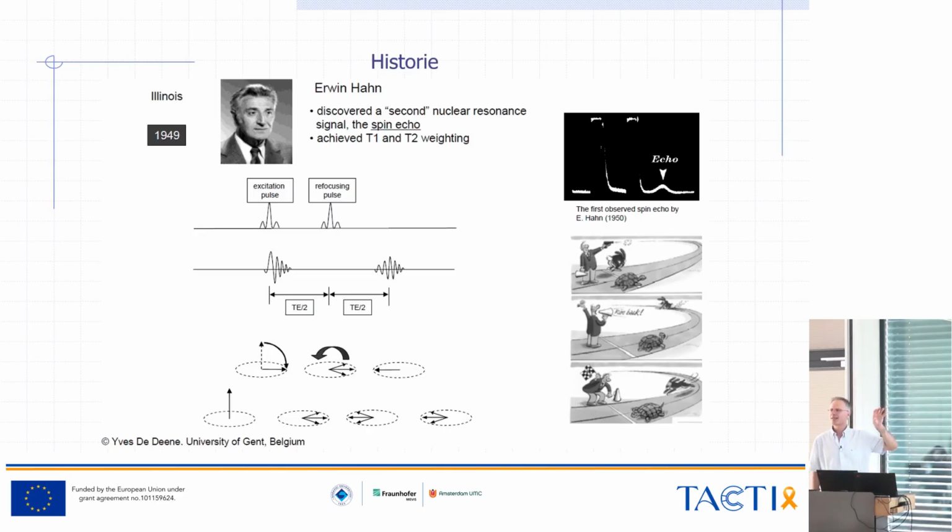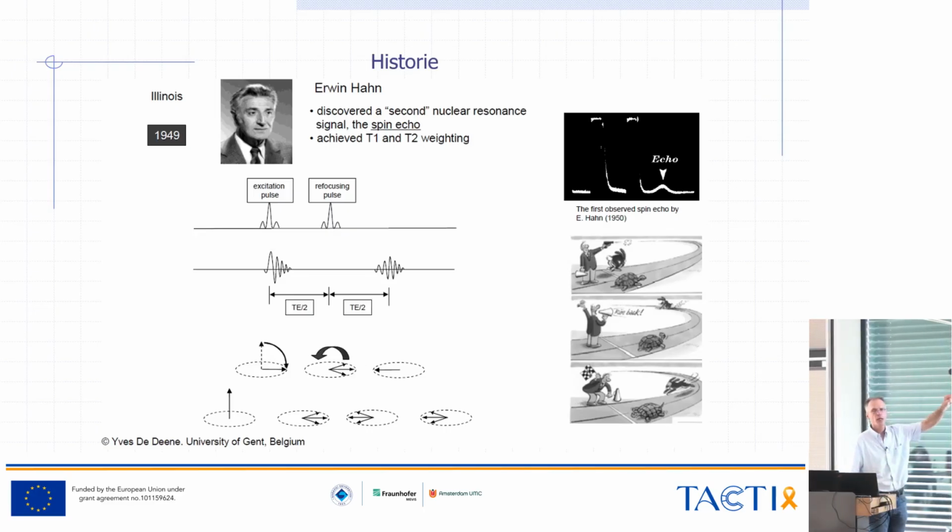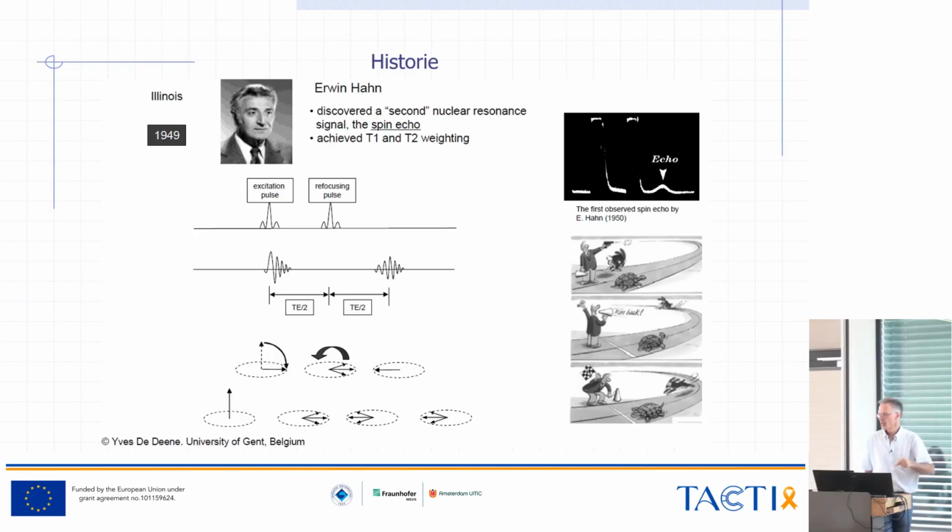And that's exactly the same as what's happening with the magnetization by applying several pulses. Klaus doesn't allow us to actually play with a teaching tool and show you, but we will do this later.